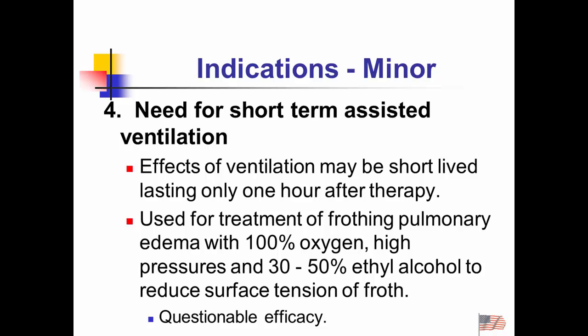Fourth reason for doing it, we don't see that often, but you can mechanically ventilate somebody with a positive pressure machine. So instead of having a big ICU-style ventilator, I'm going to use a small portable unit for short-term therapy. Rarely do we see it used for pulmonary edema. There now is the utilization of non-invasive ventilation that has kind of supplanted it. But in the old days, yes, we did use 30 to 50% ethyl alcohol, which translates to about a 60 proof.